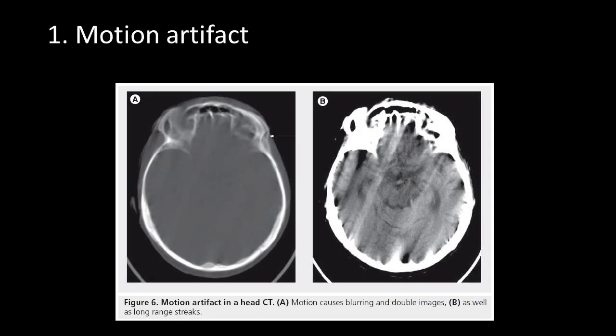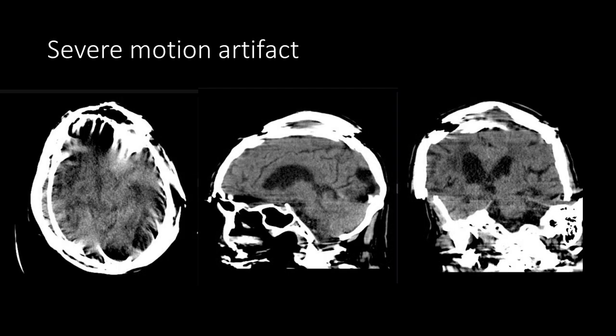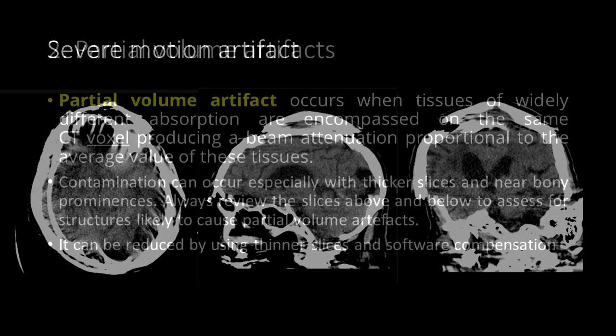This is an example of a motion artifact. In this image, the patient's movement causes blurring and double images. In a severe motion artifact, the violent movement causes the skull to appear as if it has been cut.